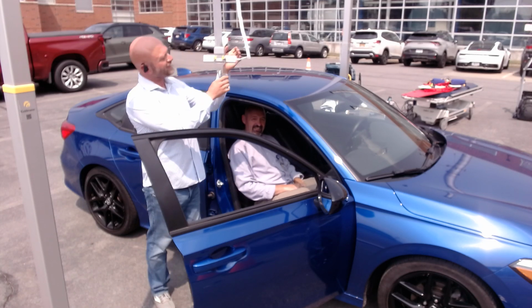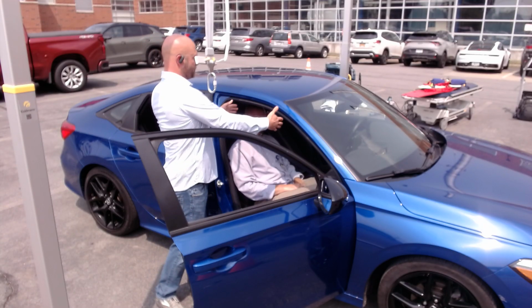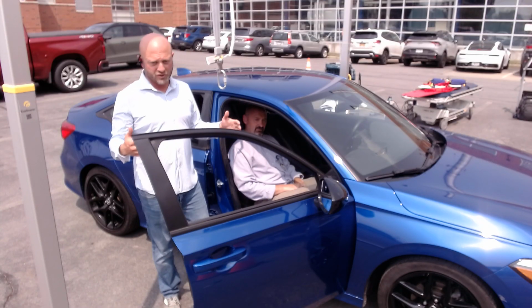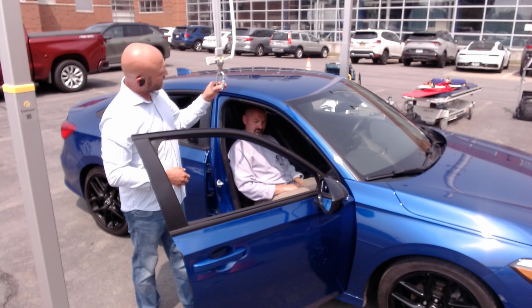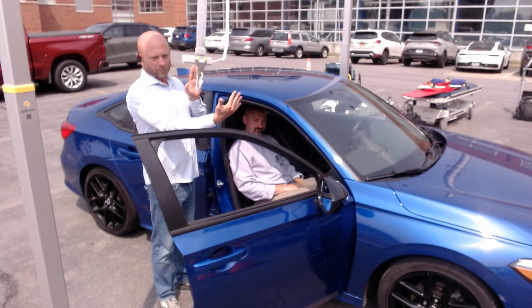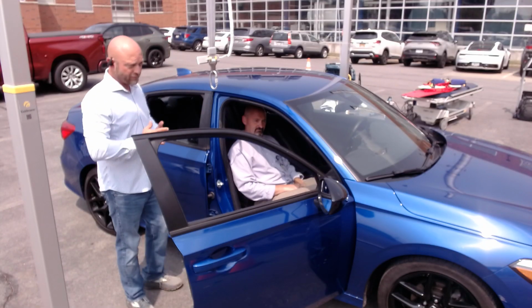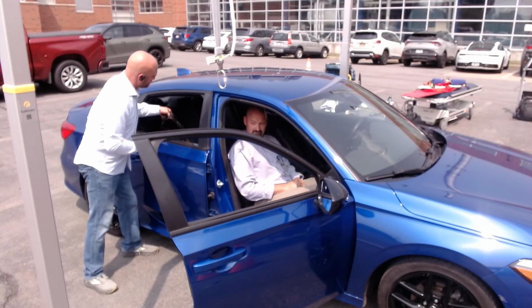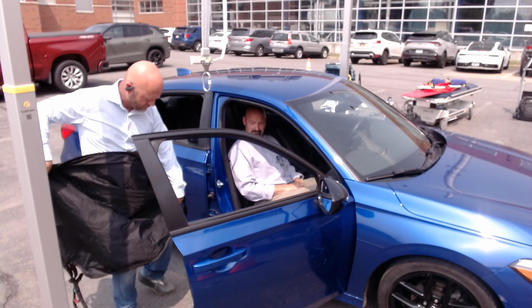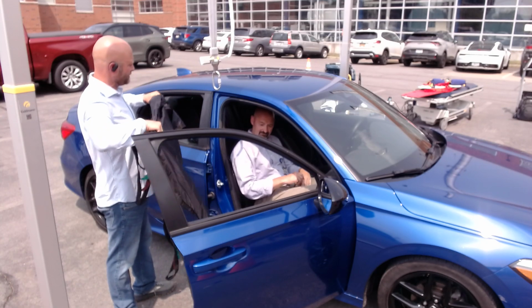All right. So the other challenge is a sling bar, right? So if we have a sling bar and we're pulling up, you again have to watch here so the sling bar is not damaging the patient's vehicle. So again, this manufacturer came up with a way of using a carabiner to eliminate the sling bar. So we're going to apply the sling, and then we're going to pull Chris out of the vehicle using the seat. So ideally, you would have two people here.